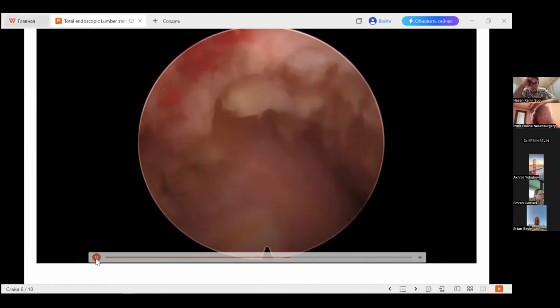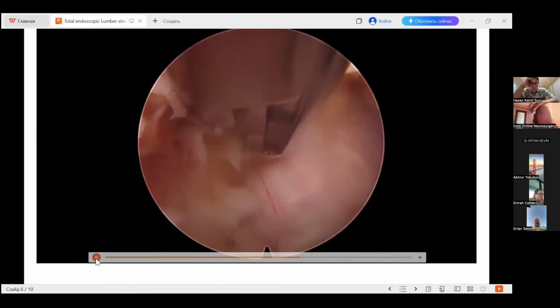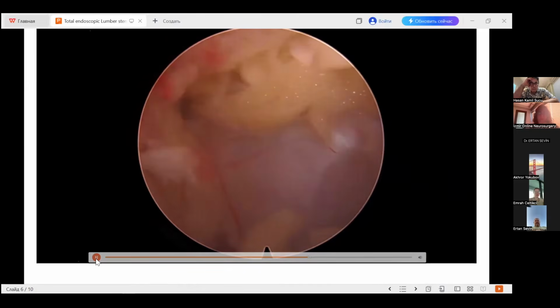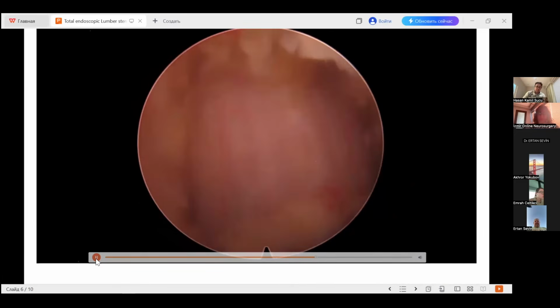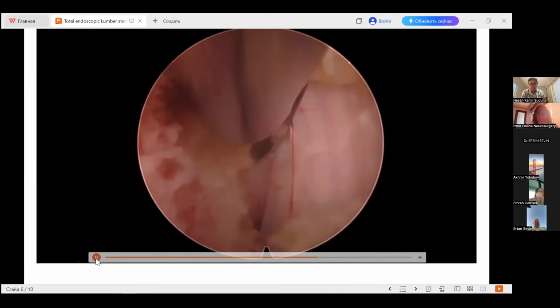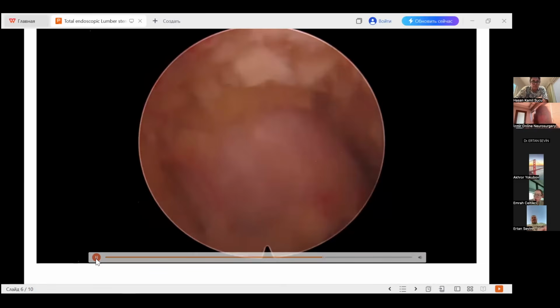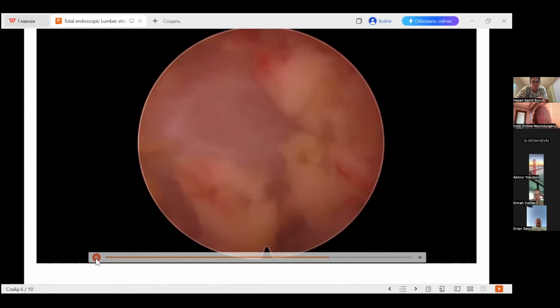Yeah, I make sure I check with X-ray at the time. I have to remove more of the cranial part. This is Kerrison 4. See, it's very safe. We can control the Kerrison totally under vision. Yes, on this ipsilateral side I already did the decompression. Already I'm seeing the lateral margin of the dura. This is ipsilateral, 5, 6 o'clock.